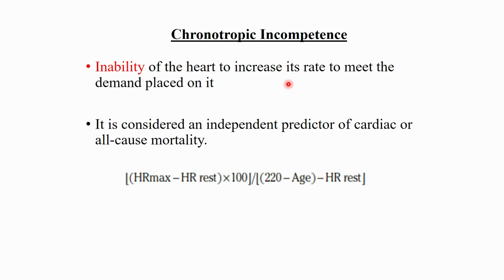He's not an athlete. So any of us could have it, actually. We may be physically deconditioned. In the second or third stage, we might reach our age predicted maximum heart rate, or 85% of that. It's not interpretable then. That's called physical deconditioning.